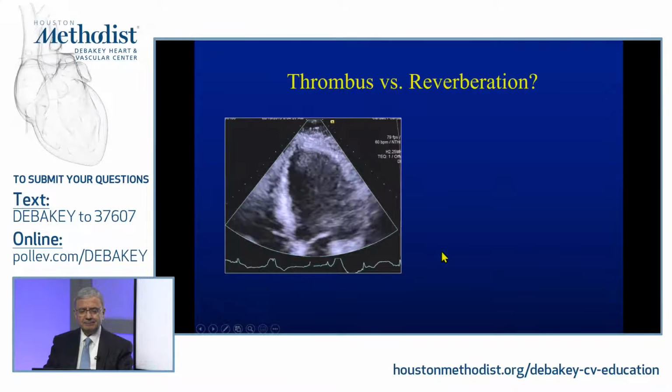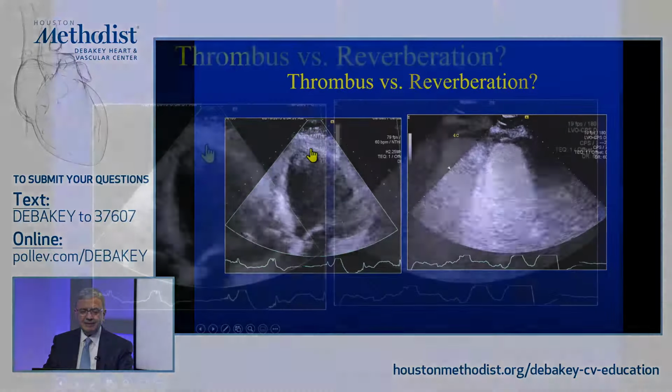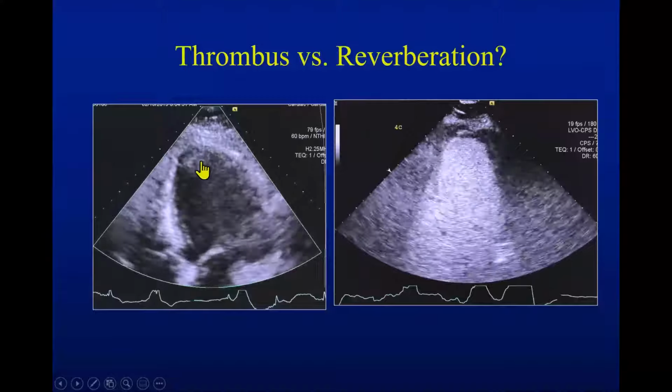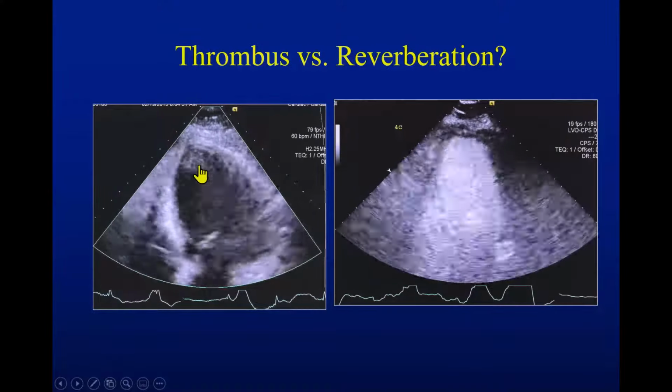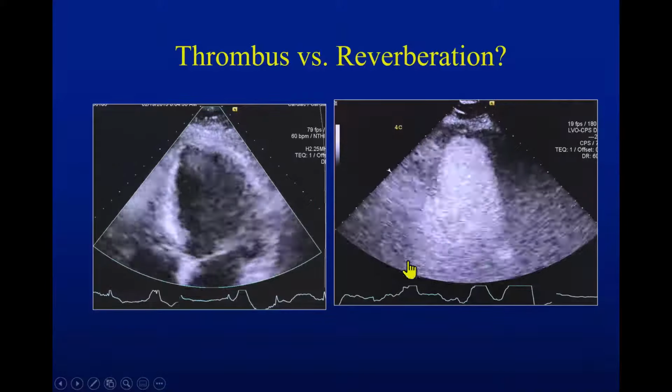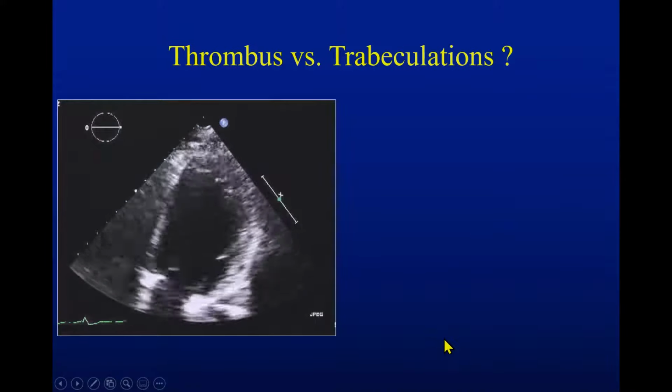Think about it a little bit. Reverberation. Now you could say, well, maybe it's not completely attached to this and you use other windows. Yes, you have to do that. Change frequencies. Yes, you have to do that. Transducer. But I think contrast certainly would be very helpful for you. Take a look at this.